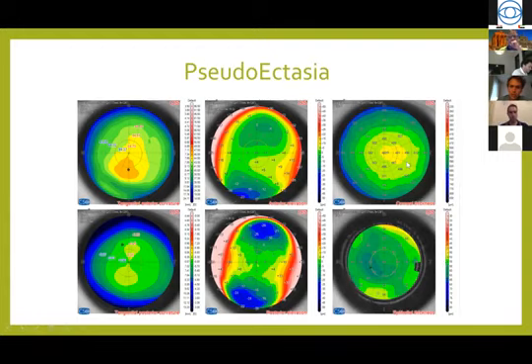If you ask me, I would not do LASIK on this eye, of course, because the cornea is thin anyway. But if you ask me, would I do a PRK? Of course, sure. This is not an abnormal cornea. This patient has only an inferior asymmetry because of epithelial thickening, probably because of contact lens wear or whatever the reason. If it's contact lens wear, then just wait, and as studies have shown us, this will probably become normal.